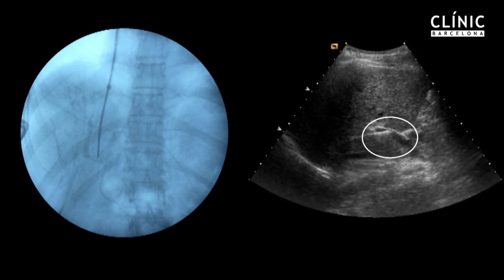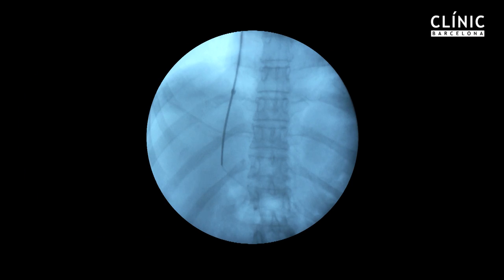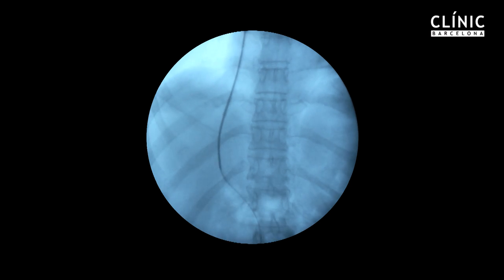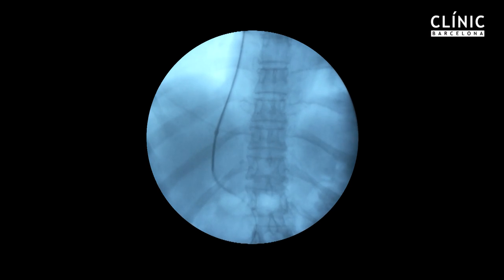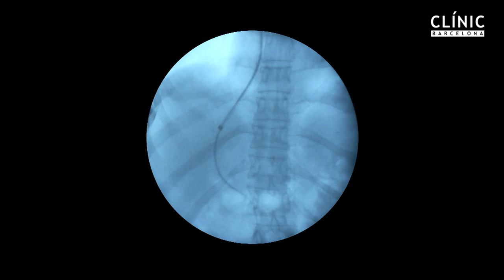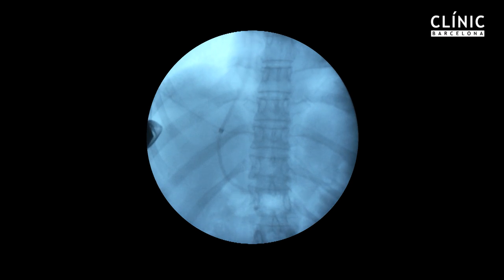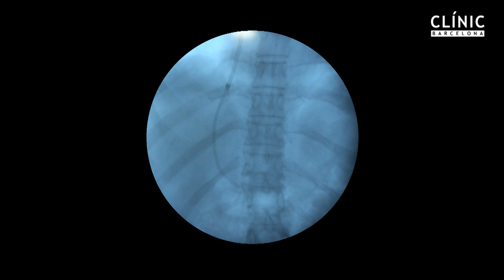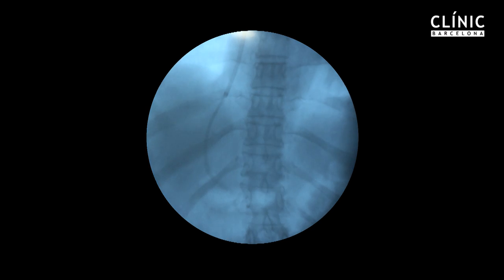Ultrasound is used to confirm that the portal vein has been reached and to ensure that the site of access is actually intrahepatic. After successful puncture, the portal vein is catheterized and portal venous pressure measurements are obtained.